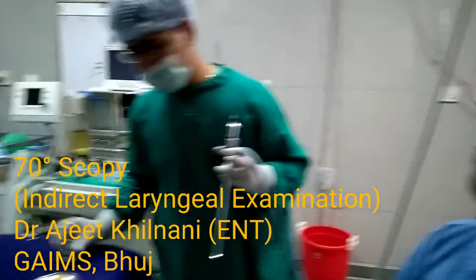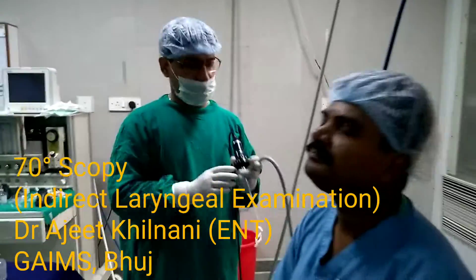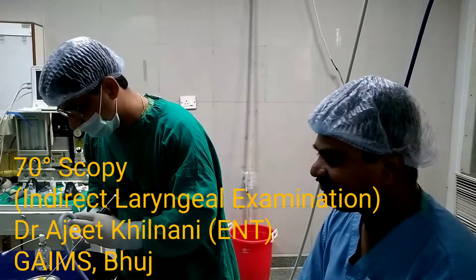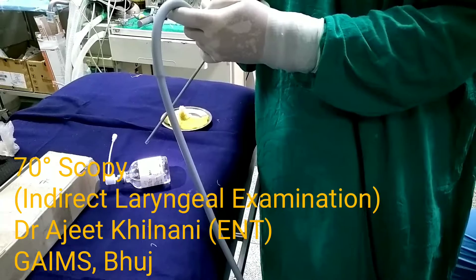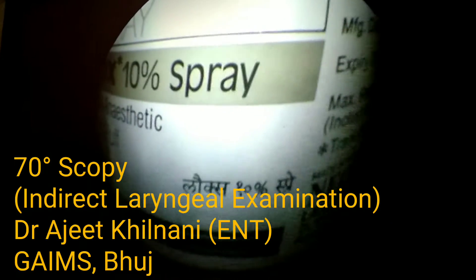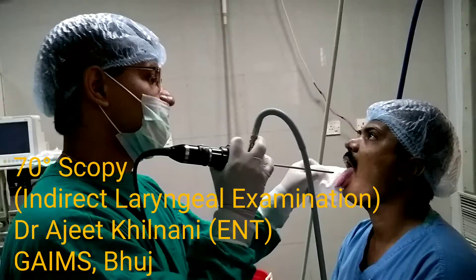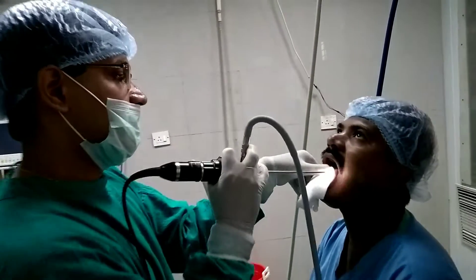Hello everyone. In this video, we will see the structures seen on indirect laryngeal examination. We have sprayed the larynx of the subject with 10% lignocaine spray. We are focusing the 70 degree scope, then we insert the scope.